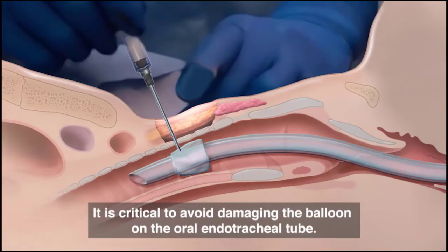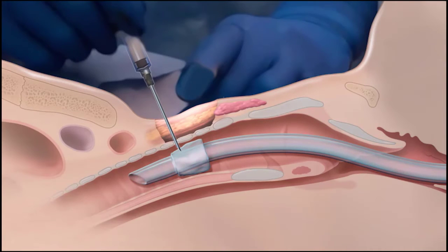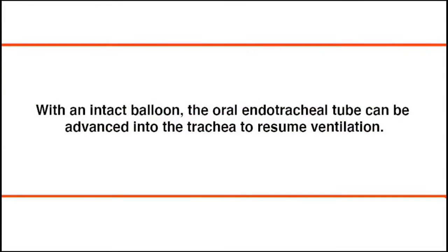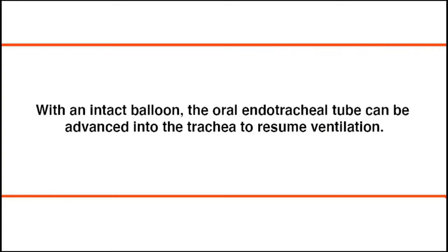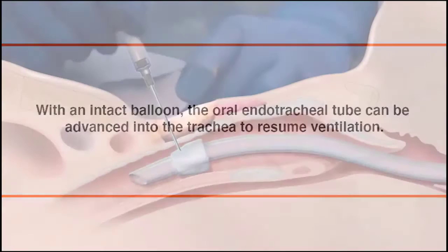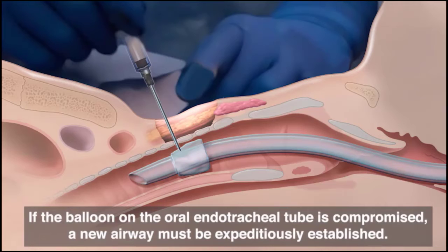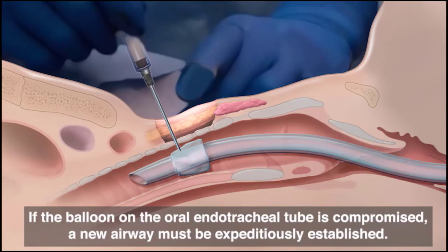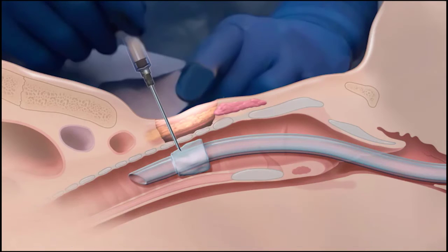It is critical to avoid damaging the balloon on the oral endotracheal tube. In the event that the patient's condition becomes clinically unstable or there is difficulty performing the tracheostomy while the balloon is intact, the oral endotracheal tube is simply advanced to its original location and normal ventilation is resumed. Additional supplies or personnel can be gathered. If the balloon is compromised, so too is the ability to provide positive pressure ventilation. A new airway must be expeditiously established by means of either a tracheostomy or oral endotracheal intubation with an intact tube.